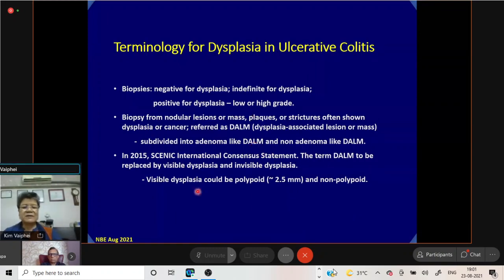And there is a little bit of change. I think people keep on changing. I am slightly not very willing to. The presence of dysplasia is important. Apart from that, what term you use is a different issue. But dysplasia should never be missed. And any kind of different looking mucosa has to be sampled when a gastroenterologist is doing endoscopy.